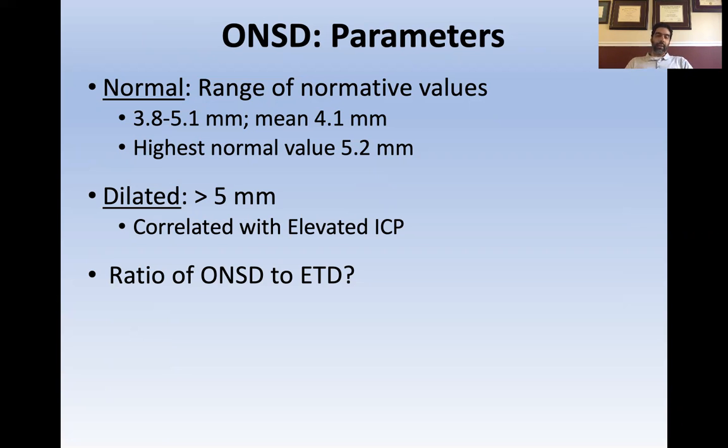Okay. There have been some postulated limitations to this number, using a single number for everybody. Again, is there some difference when it comes to gender? Are there some differences when it comes to ethnicity, height, body surface area, that kind of thing? It's sort of unclear. There is clearly some range in normal values, but is this range actually bigger than this? I don't think we know 100%.